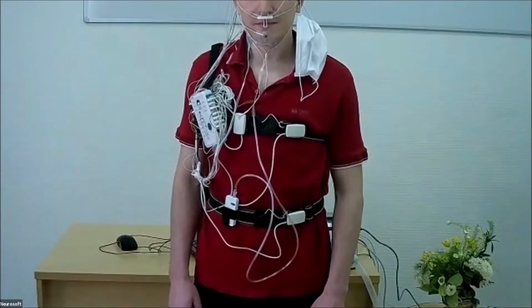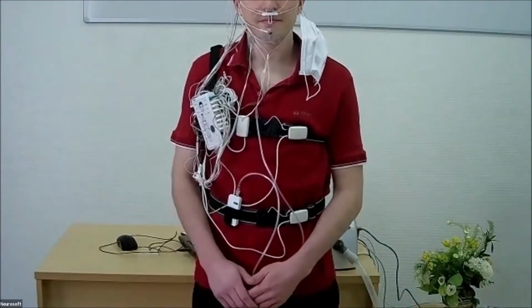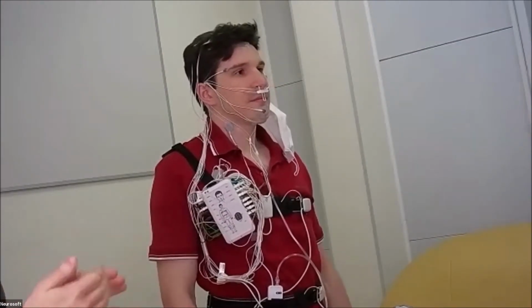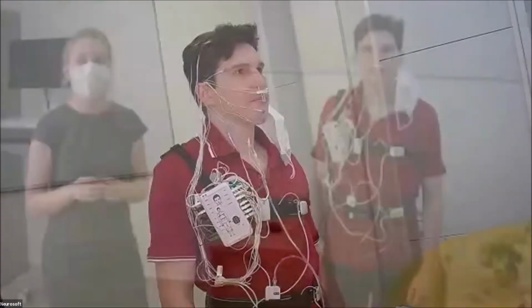And in this case, we use respiratory inductive plethysmography. We use a rib belt, respiratory inductive plethysmography rib belts with the sensors. But we can use other belts with other sensors.